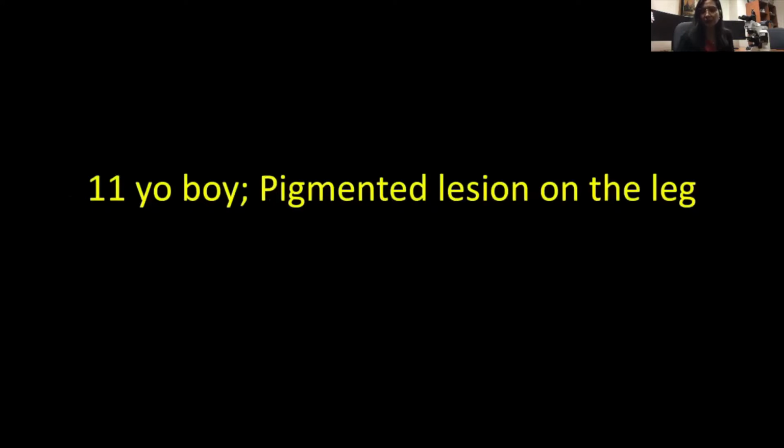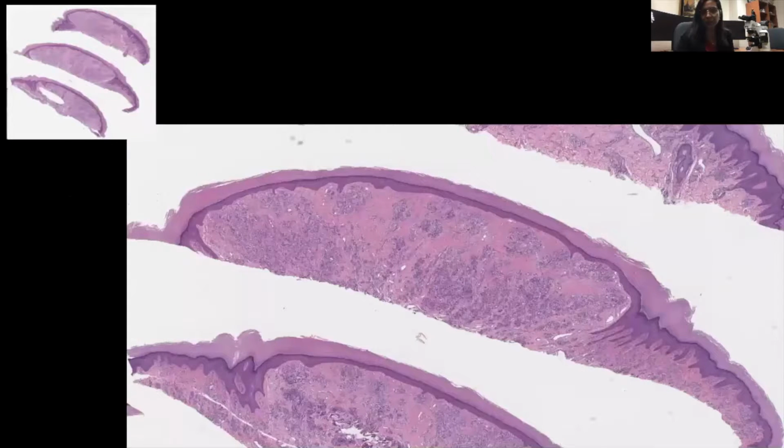Next case, an 11-year-old boy, pigmented lesion on the leg. You see here the shave biopsy and some fibrosis in the background.